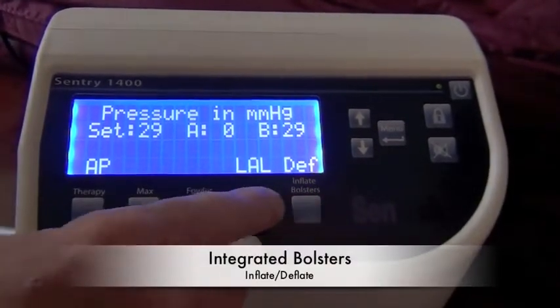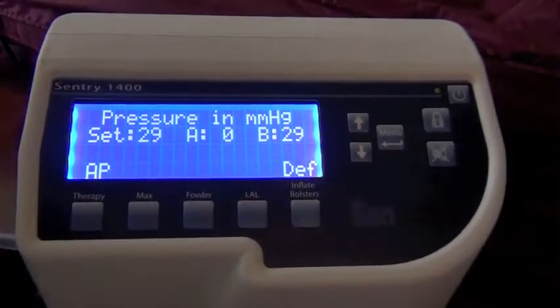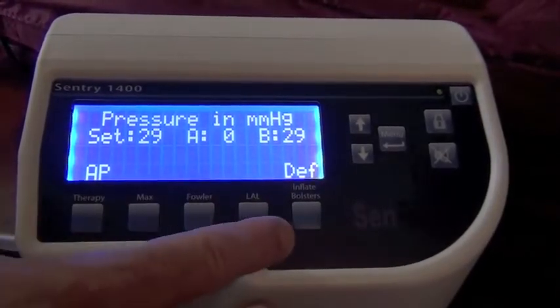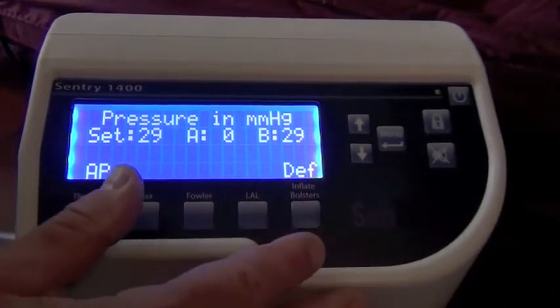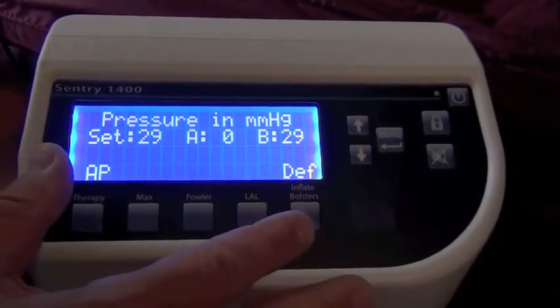Finally, we have, and I'm going to turn that off. Finally, the last button here is the inflate and deflate bolster button. The mattress, and I'll show you this in a moment, has integrated side bolsters on it, and the integrated side bolsters are inflated all the time. That gives structure and stability to the mattress itself.